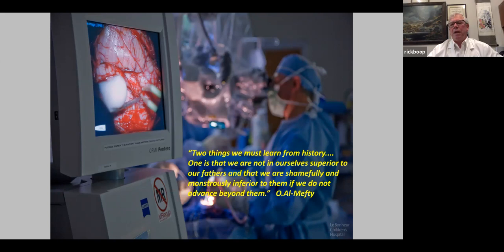The year before we got our intraoperative MRI, our habit up until that time was to finish surgery, do an MRI the day afterwards, and if we had residual tumor, bring the children back and reoperate to get it out. We did that in 8% of the children the year before our intraoperative MRI. The first year we had the intraoperative MRI, that dropped to 2%, and the next year to 1%. So now it's very unusual for us to have to take children back to surgery for residual tumor, because we can do a scan at the time. Thank you.